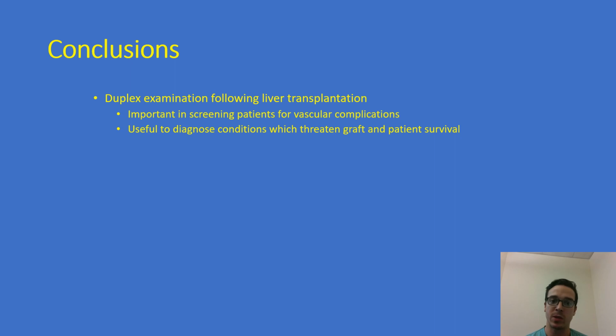Duplex examination following liver transplantation is a standard part of the postoperative period for liver transplant patients. It is important for screening patients for vascular complications and can help diagnose conditions which threaten graft and patient survival.